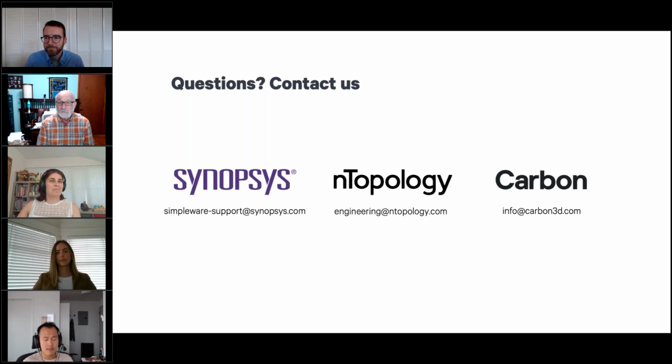Yeah, and I would second, or third, everything that's been said. I think this workflow is really exciting. I think the possibilities for patient-specific medical devices with the three platforms that we've shared with you today are many. I think it will be exciting to see more of the medical devices produced in this digital workflow.